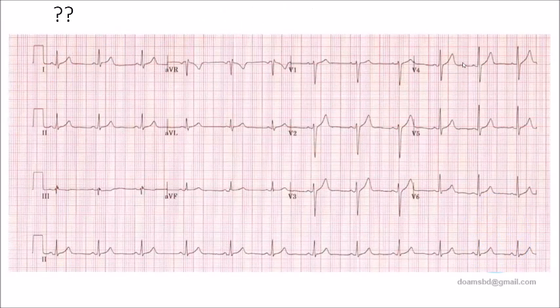So now again, look at the ECG, please. Just be careful, 1 minute or less than 1 minute. Look for any gross abnormality, as I told you before. Can you see it? If not, come to the rhythm. Is it regular or irregular? Check apparently the rate, and definitely try to calculate the rate with your previous knowledge of how to calculate the rate.